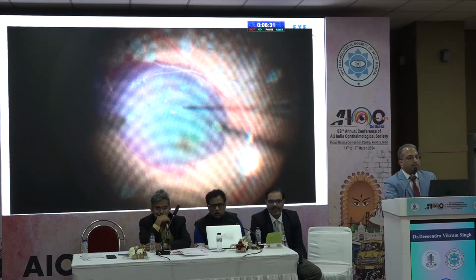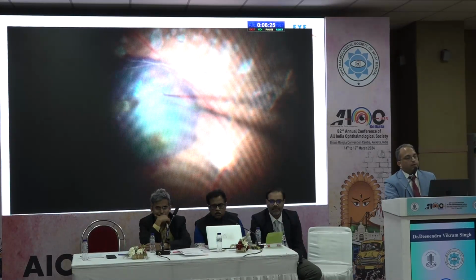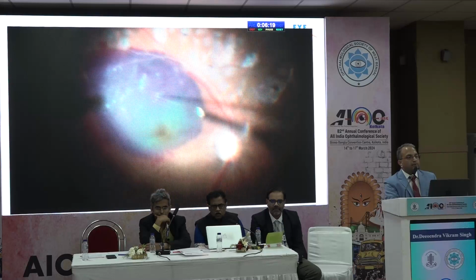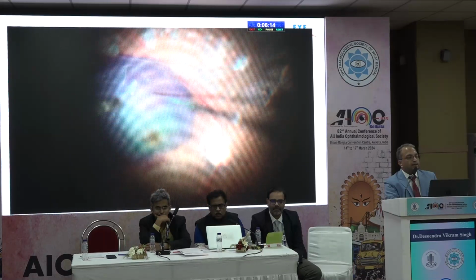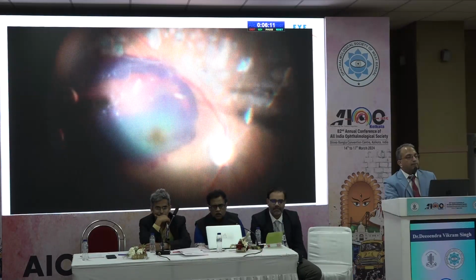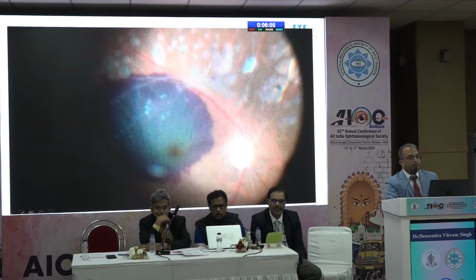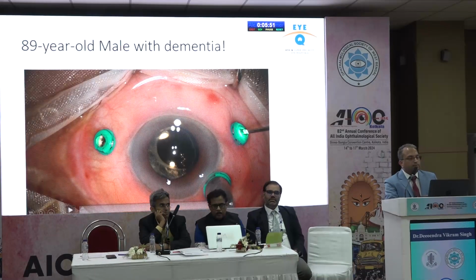Let's see what happens. And again, the point Dr. Reddy was highlighting, that if you are not able to get in, don't try that point again and again, because you will end up creating a larger retinotomy. So go to another area, and this blanching happening tells you that you are still not in the subretinal space. Yes, and then once you are in the subretinal space, you can see I have injected TPA followed by air. And this is the fundus picture 4 weeks after surgery, significant displacement of blood, and we have just injected air in this patient. So again, doing very well with this minimalistic approach.